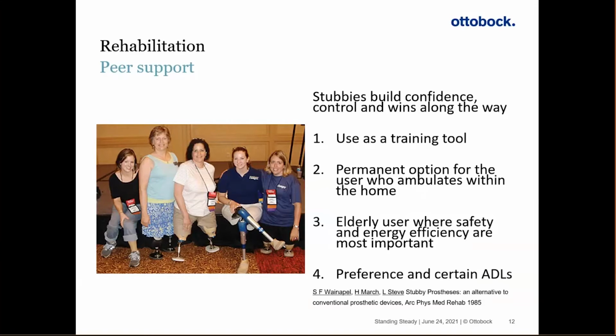If they do things where they just want to be lower to the ground, they might just sit on the floor and play with their children with their stubbies and not have their longer legs on at those times, or get up in the morning and make their coffee and go about their day and do the things that they need to do before they put on their longer legs to go out in the environment. So it just really depends on the individual and their needs.